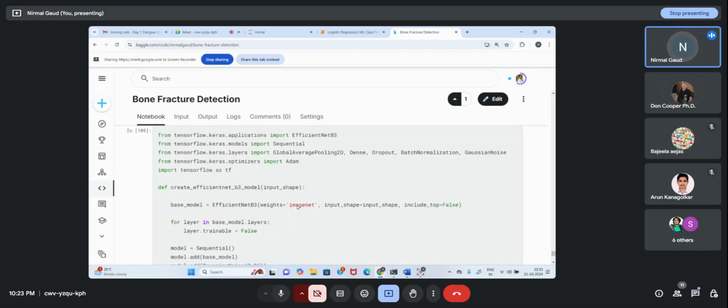Similarly, sir, these are the ranges of the architectures, depending upon their weight, training, and layers. So, sir, I took B0, that is the basic model, the smallest, lightweight model. Then I took an average one also, and I checked.